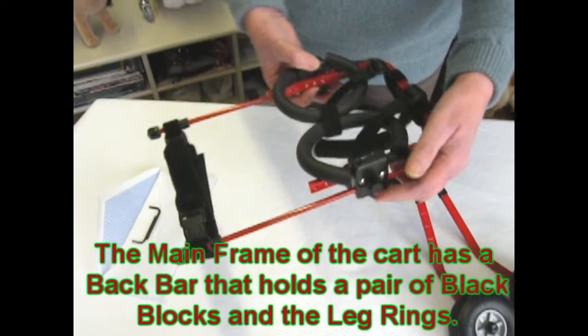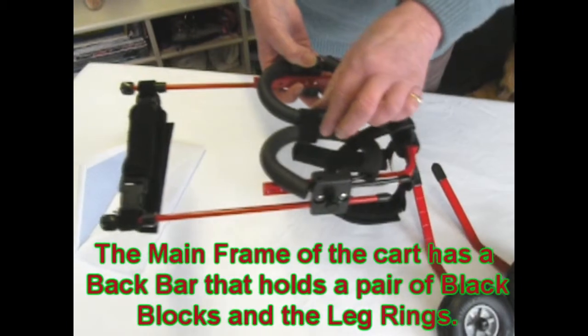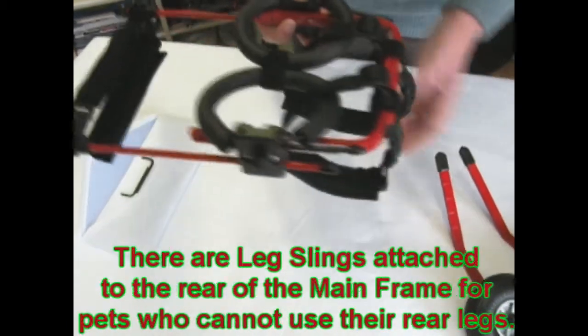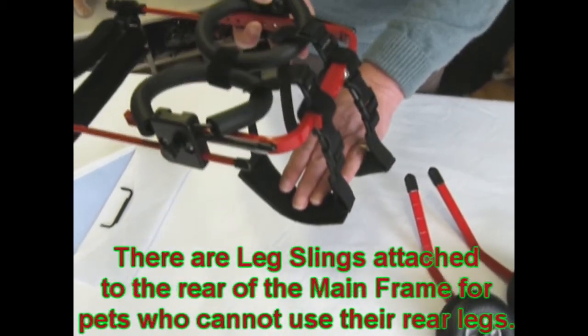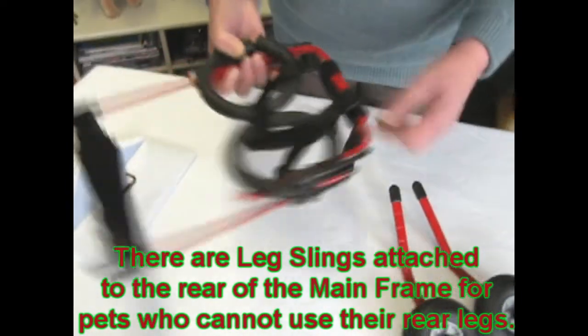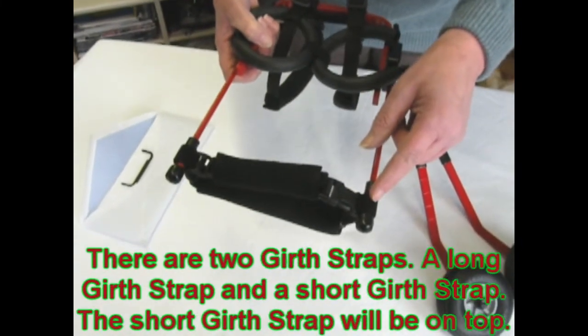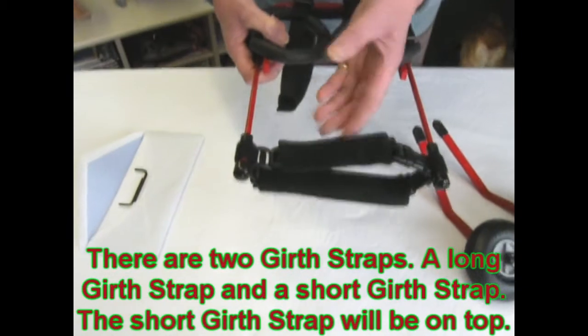The mainframe consists of the back bar, which holds the blocks and your supportive leg rings to the cart. The leg slings are used in the event that your pet has no use of the rear legs. These are the side bars with girth straps attached — there are two girth straps, a short one and a long one.